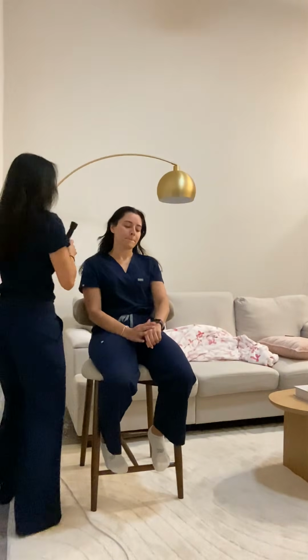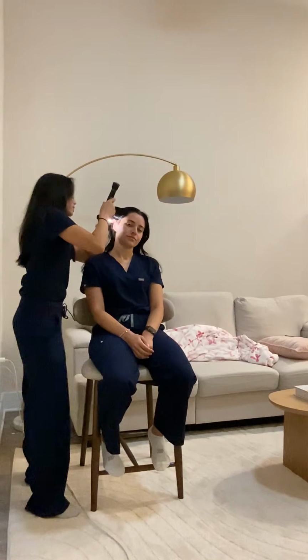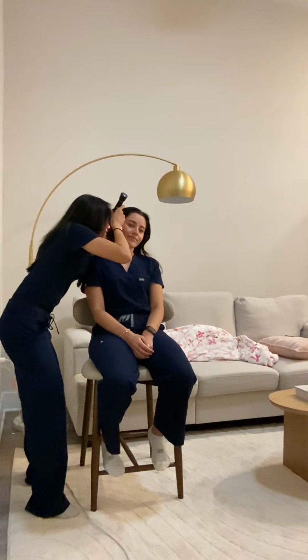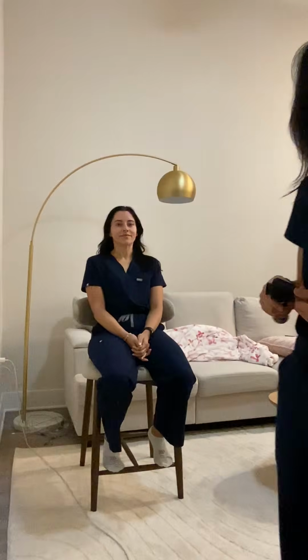Using my pinky as a fulcrum, pulling the auricle up and outwards, and visualizing that tympanic membrane pearly gray once again, and all of its landmarks. Perfect. And that concludes the ear examination. Now I'm going to change out the speculum and ensure that it is the correct size, and we will go ahead and get started on the nasal exam.